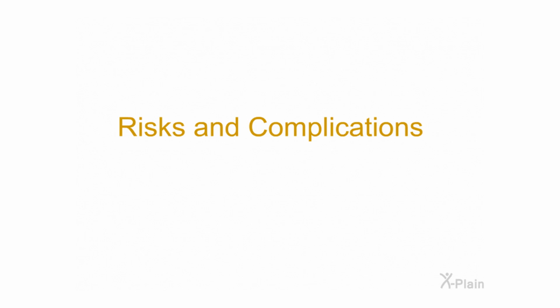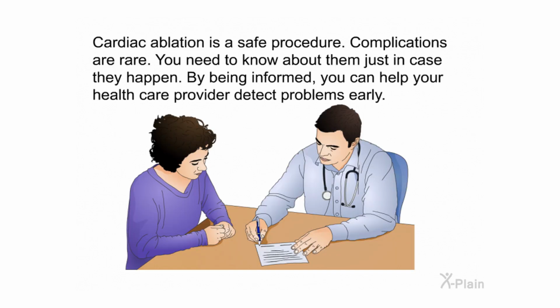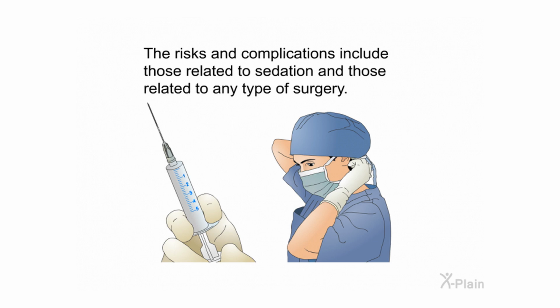Risks and complications. Cardiac ablation is a safe procedure. Complications are rare. You need to know about them just in case they happen. By being informed, you can help your healthcare provider detect problems early. The risks and complications include those related to sedation and those related to any type of surgery.